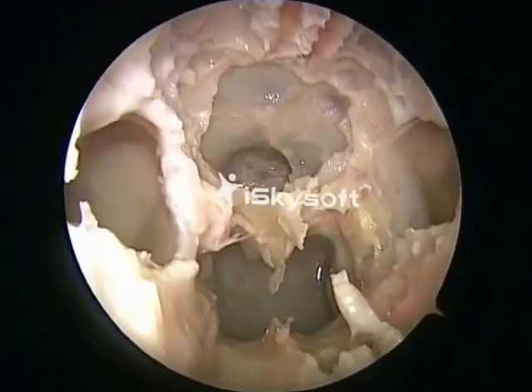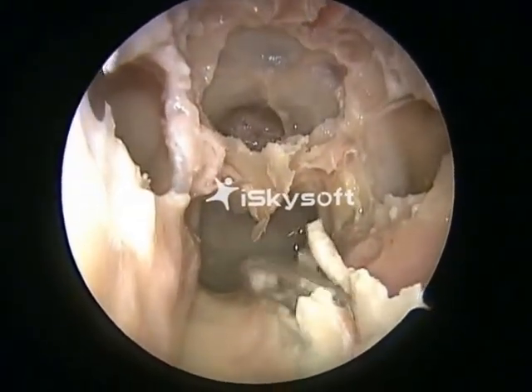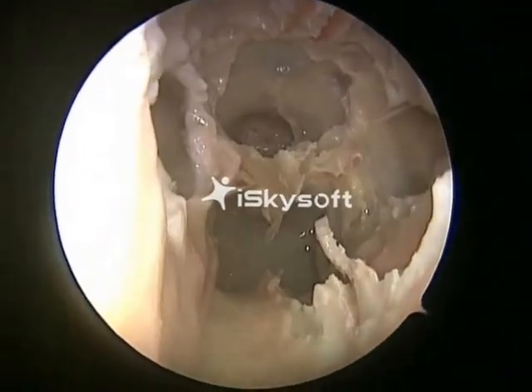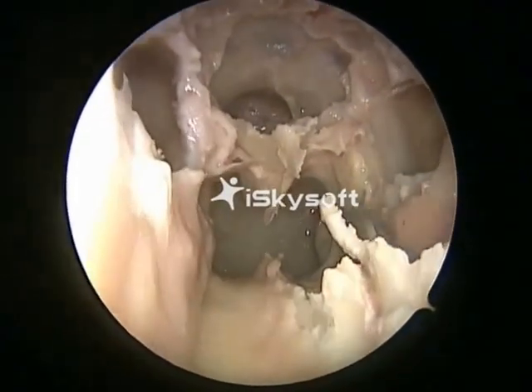And this is very essential for transclival approach. It has to be taken till the roof of the soft palate. It should be reduced flush till the floor.